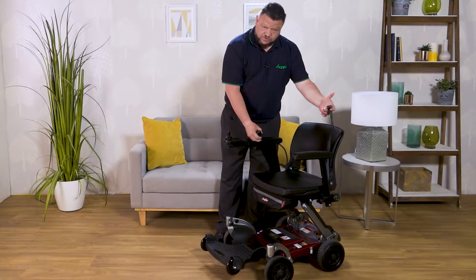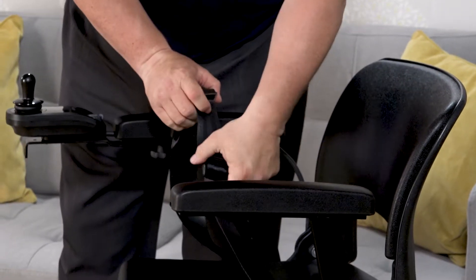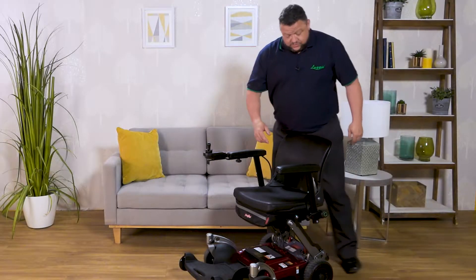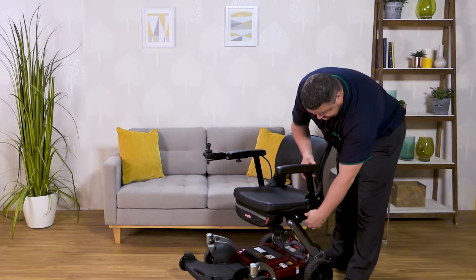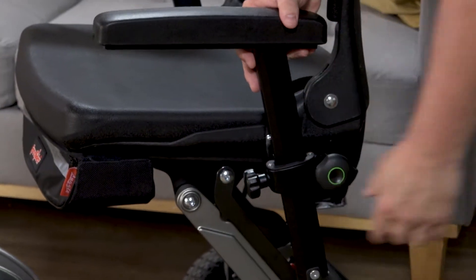Just to make you feel a little bit more secure, we have a seatbelt. It's pretty straightforward and can be adjusted to suit your own size. A nice feature we've also brought out is that the armrest can be adjusted height-wise as well.